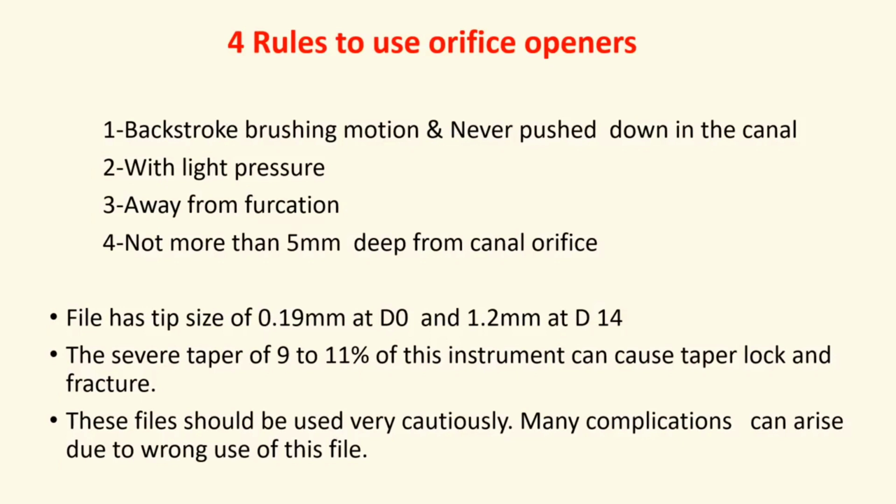These are the 4 rules to use these orifice openers. One is a backstroke brushing motion, and never push down in the canal. Second is with a light pressure. Third, away from furcation. And fourth, not more than 5 mm tip in the canal.